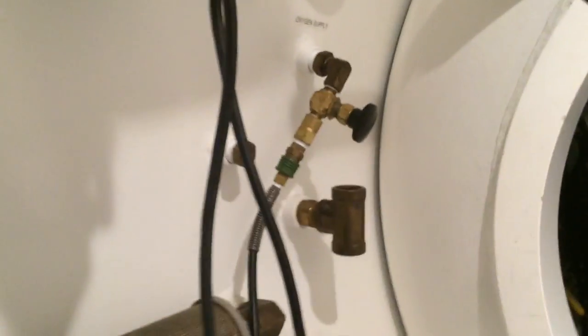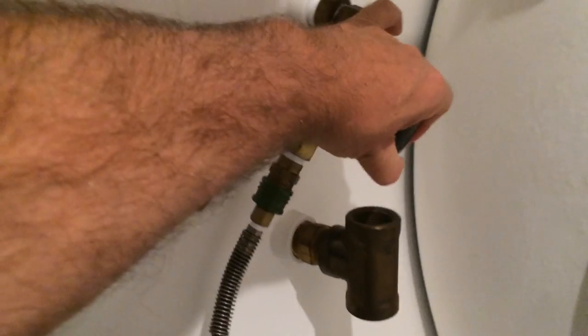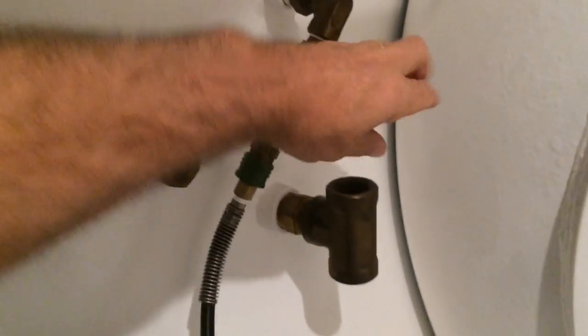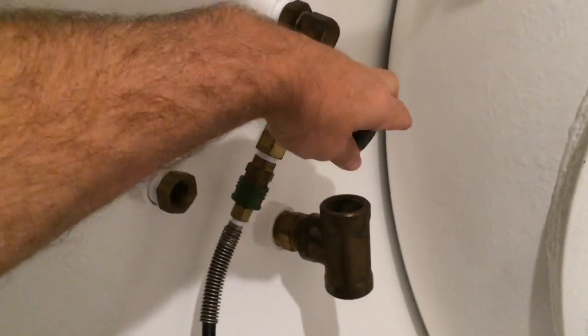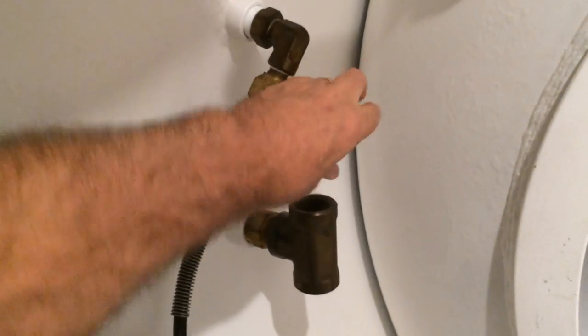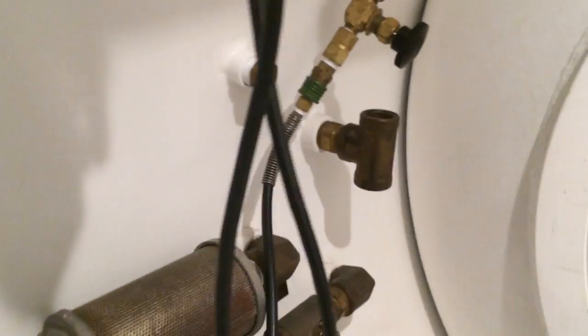Looking inside the outer lock, here is our corresponding oxygen supply. Opening this valve three or four turns is sufficient — it doesn't need to be open all the way, just like a scuba cylinder.